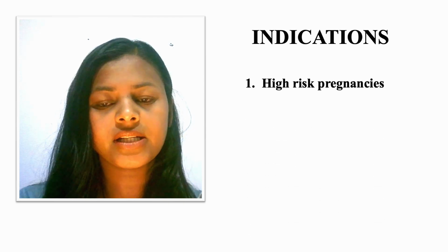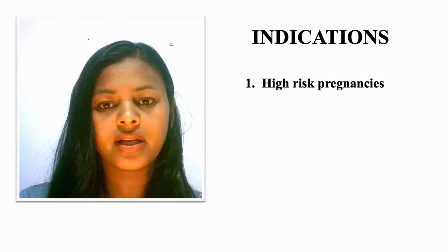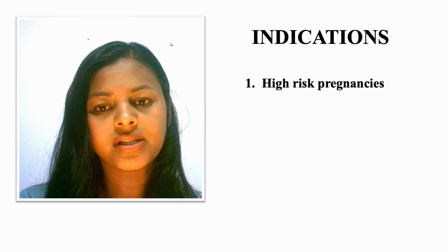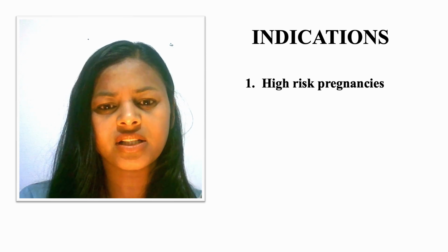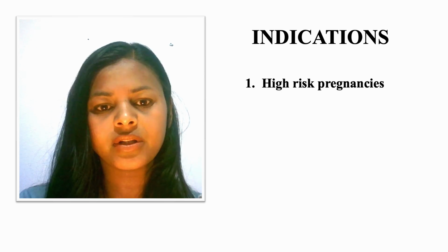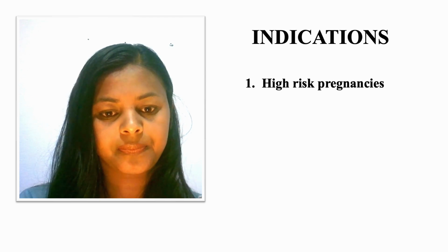Let's talk about the indications. We do not always do the CTG for every pregnant woman unless there are indications such as high-risk pregnancy. If the pregnant woman is suffering from heart disease, hypertension, or is an elderly primigravida, that is, pregnant for the first time over the age of 35 years, in that case we do the CTG.